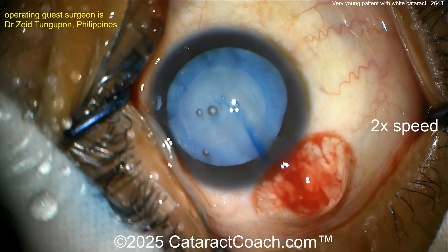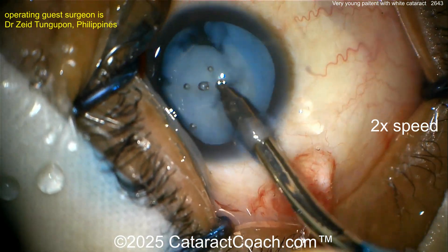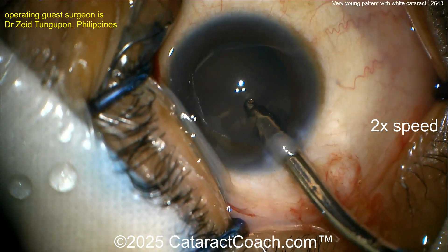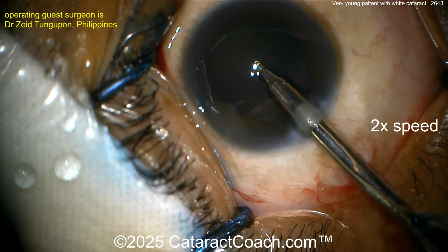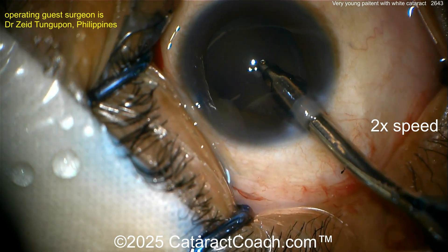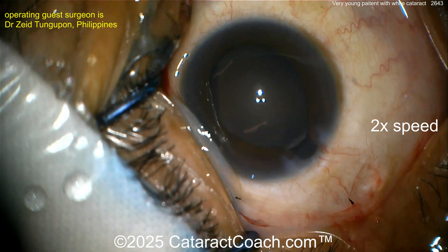Let's see what's going to happen here — right to the I/A probe. Exactly. Let's just vacuum it down. And look at that — it is gone. Absolutely gone. Now why did the patient get a cataract? Sometimes it's from trauma, sometimes it's just bad luck. We've seen these patients in our clinic who are young, in their 20s or even 30s, and have bilateral white cataracts that came on very suddenly.